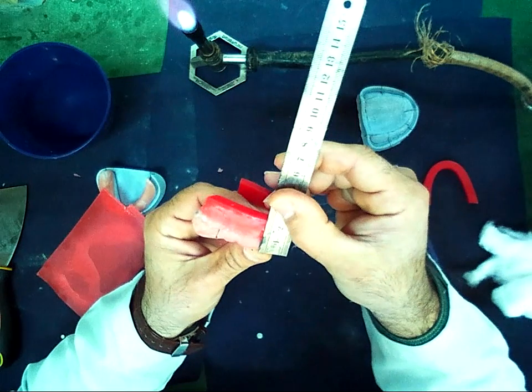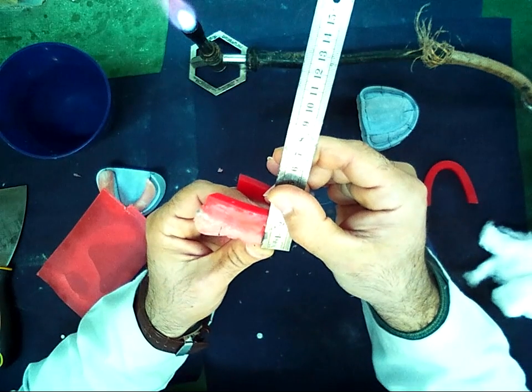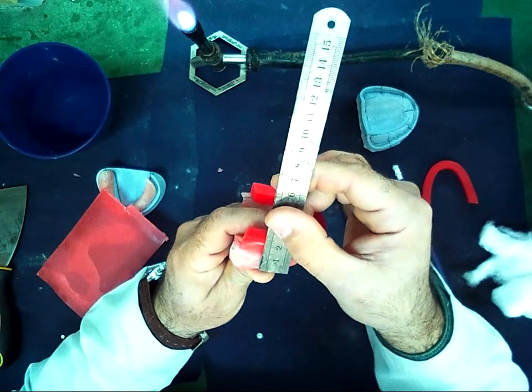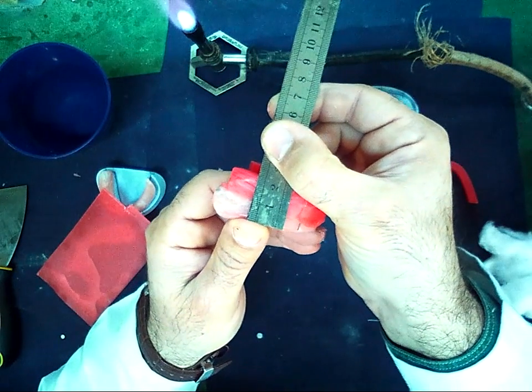When I take this measurement, it is 24. So I need to remove 2 mm only. On the posterior part, when I take my measurement, it is also 24. So I should remove 4 mm.